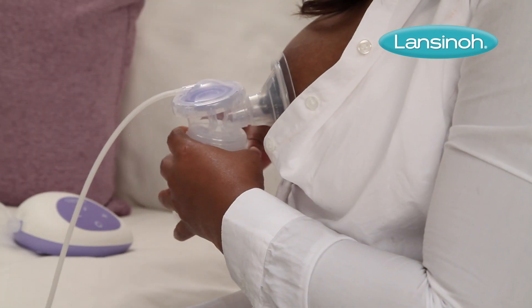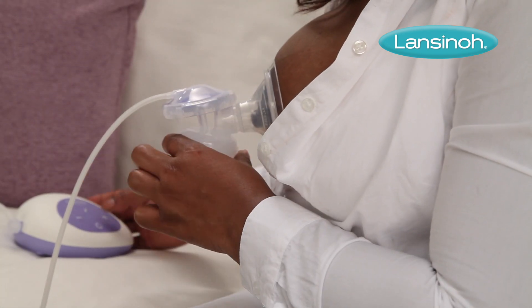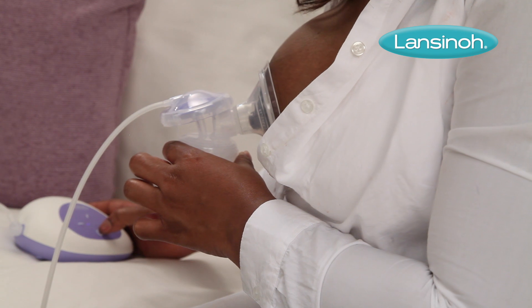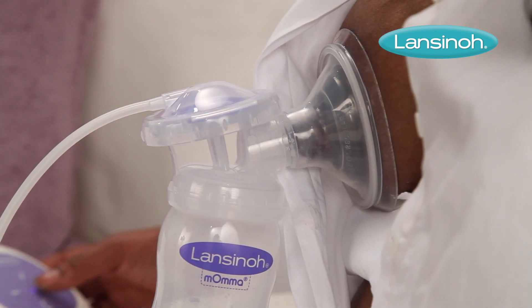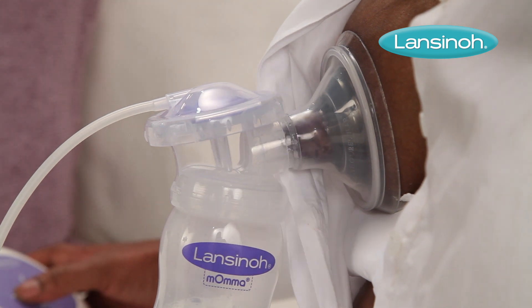The first phase, or let-down, stimulates the breasts, initiating milk flow through rapid suction. The second phase maximises milk flow through slower, deeper suction.